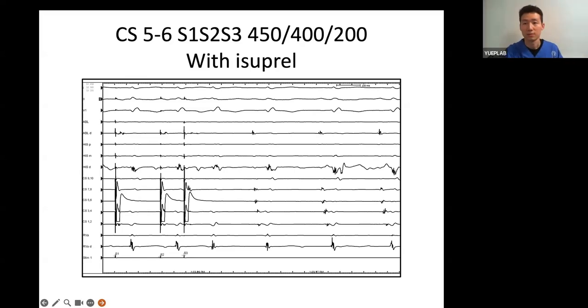Sorry. Okay. So can we conclude that the left inferior extension really participates in this tachycardia in this case? I'm just asking. I don't think there's a leftward extension involved by evidence here, because the coronary sinus anatomic variation is vertical. So I think the slow pathway is probably more to the left side than usual. I think that's what it is. Okay.